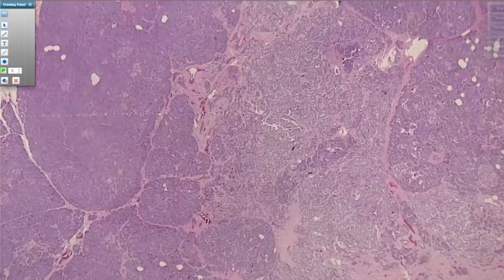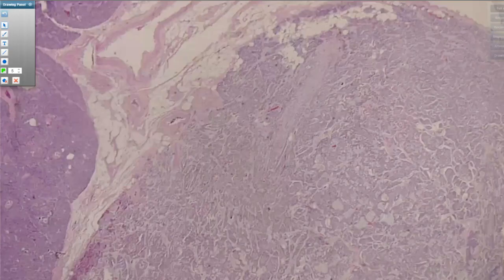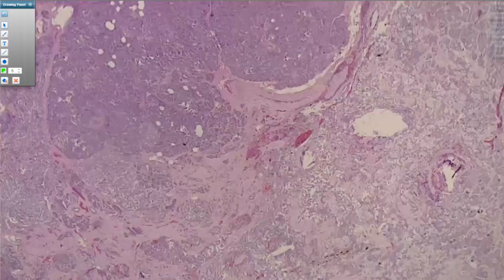All right, so I've got about 5 more minutes. So I wanted to show a couple of examples of things that are not true cysts, so that they don't have a true cyst lining, but appear cystic on imaging, and so can cause that differential to come up for the clinicians. So this first example is a lesion in a 20-year-old female, a solid and cystic lesion on imaging. It was resected and looked like this.